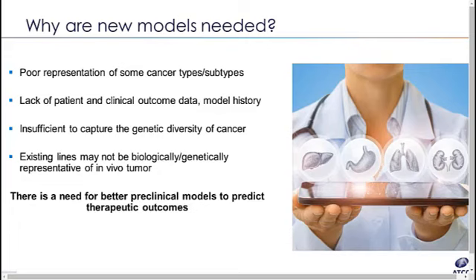Current cell line models, consisting of single cells, do not imitate the complexity of cancer diseases. They lack the genetic diversity and different cell types that exist in real cancer tumors. In short, cancer cell lines are not true biological representatives of tumors. They lack biological relevance. More advanced models such as patient-derived organoids can help address these deficiencies.